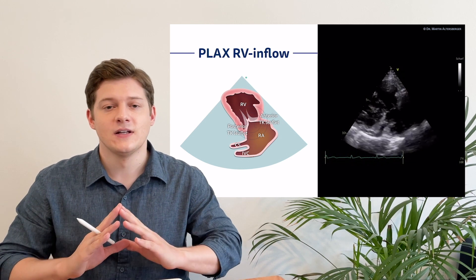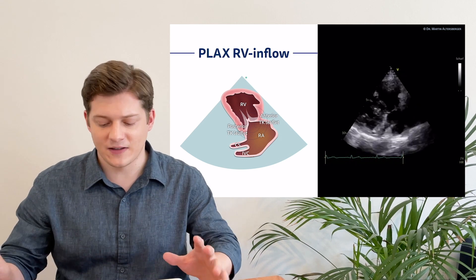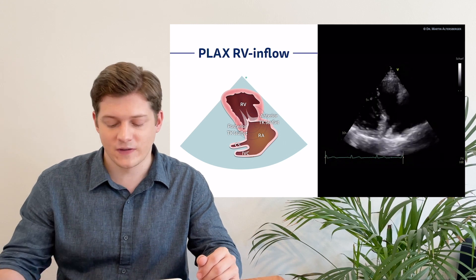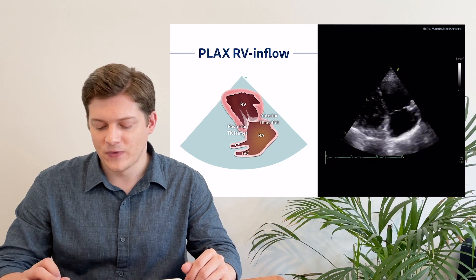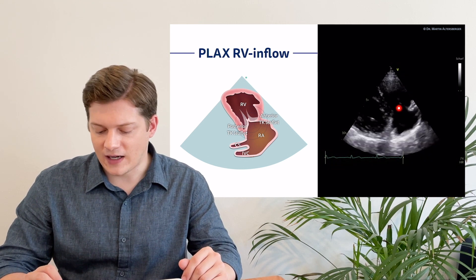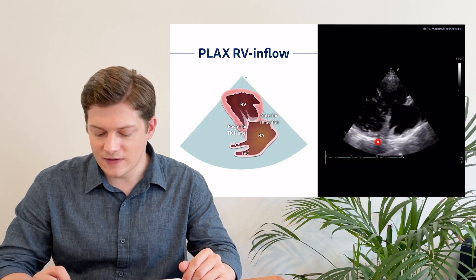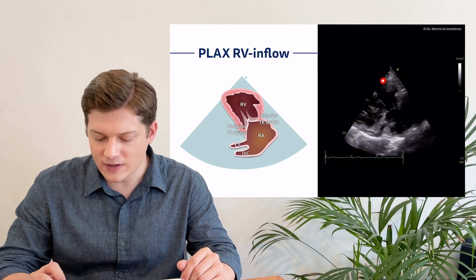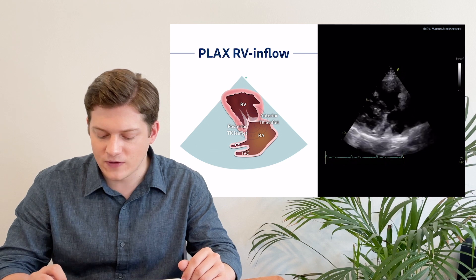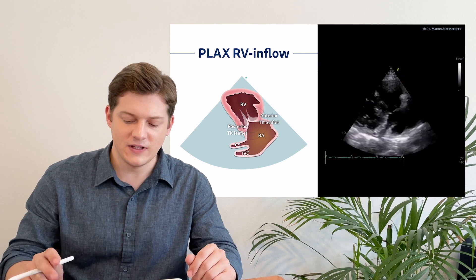You cannot see the anterior and the posterior leaflet of the tricuspid valve differentiated in any other view. This is very important — for example, in cases of drug abuse, patients can have endocarditis of the tricuspid valve, which you can nicely visualize in this view. This is the anterior leaflet and this is the posterior leaflet. The main structures we see here constitute the RV inflow — from the right atrium to the right ventricle — including the coronary sinus and the IVC, the inferior vena cava.